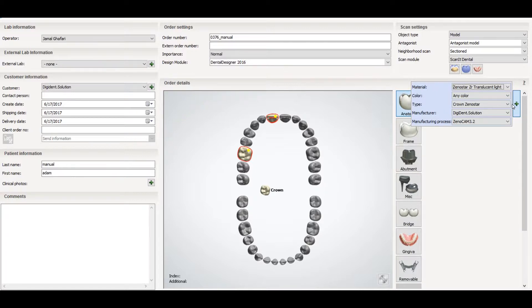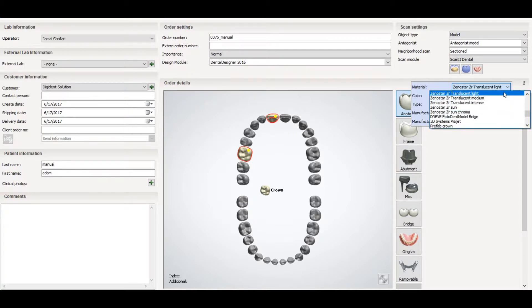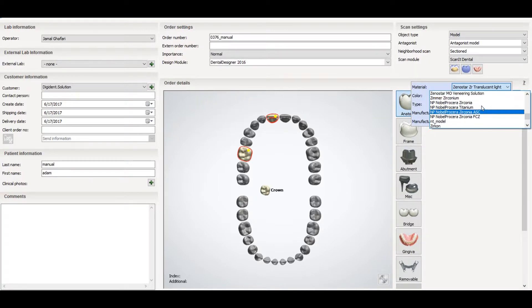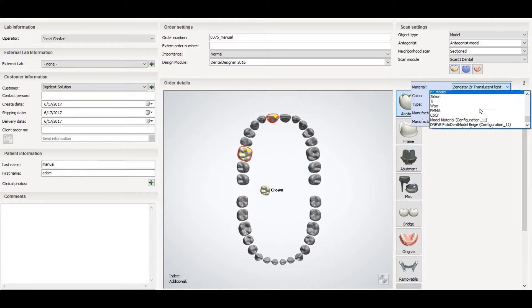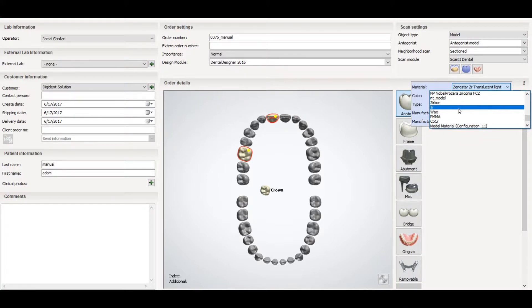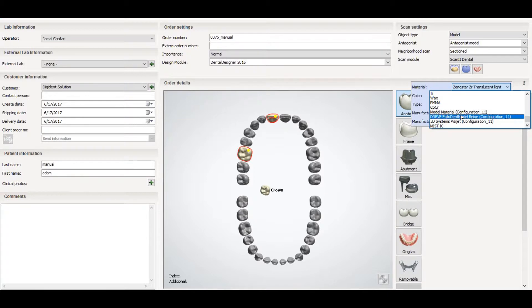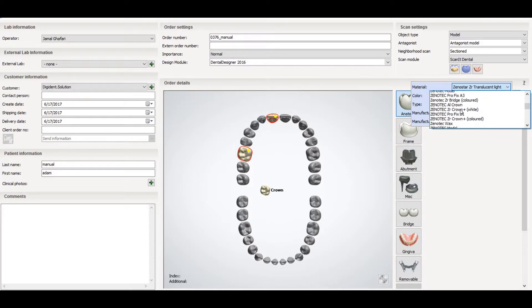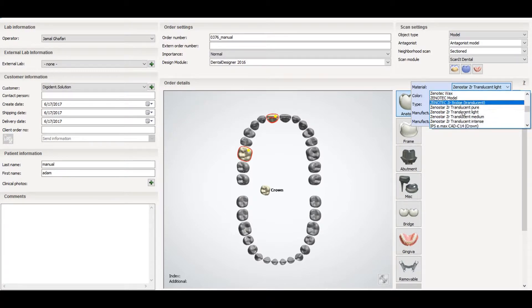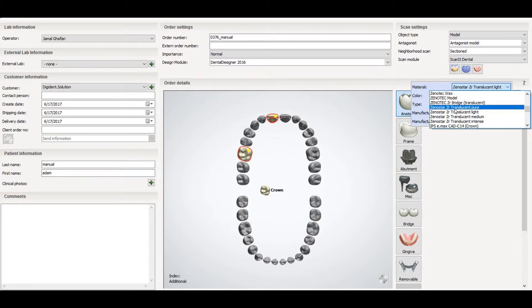When you go to the plus sign, you will find the option called material. You can check which material you want to mill — zirconium, noble, wax, PMMA, titanium, cobalt, IMAX. Whatever material you want to mill, you will select the relevant material here. Every material has specific settings in the system, so keep that in mind.